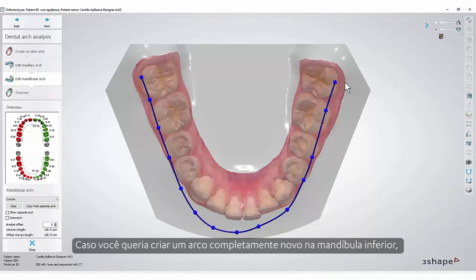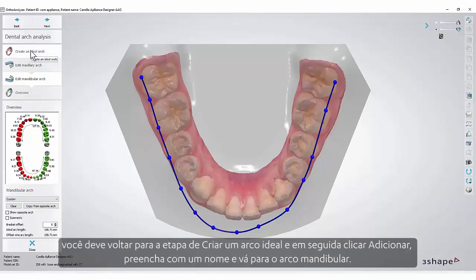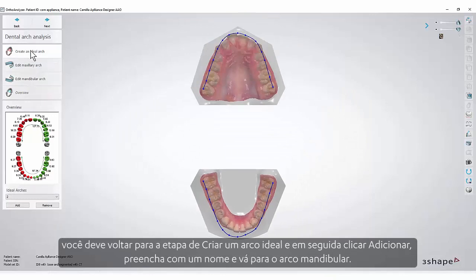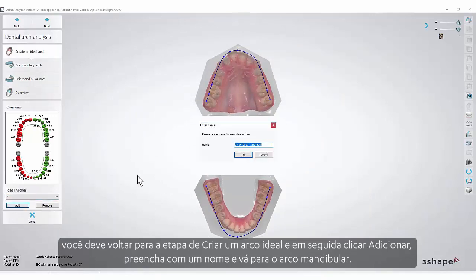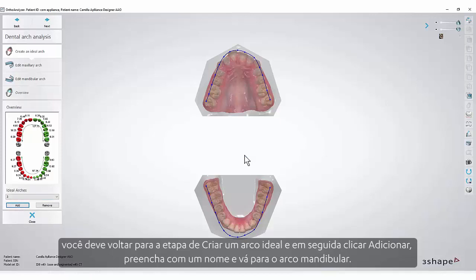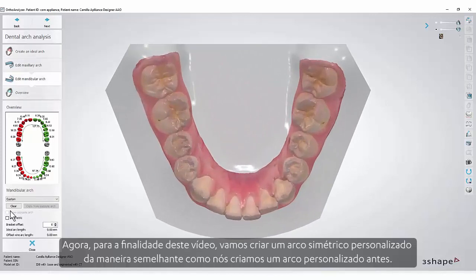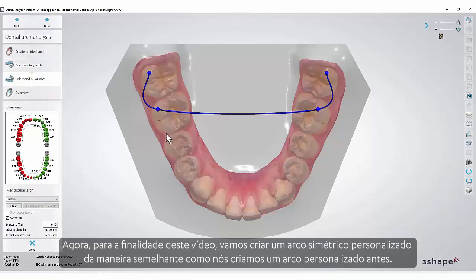In case you wanted to create a completely new arch in the lower jaw, you must go back to the Create an Ideal Arch step and then click Add. Fill in a name and go to the mandibular arch. Now for the purpose of our video we will create a custom symmetric arch in the similar way as we created a custom arch before.